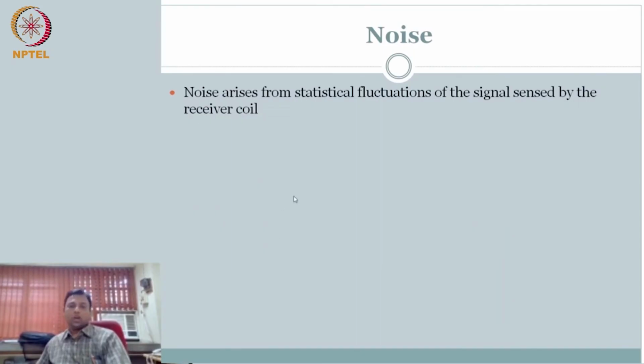Okay. So noise. Where is the noise coming from here? The noise that we are interested in covering is coming from the measurement. Here we do only one measurement. What is that measurement? We are using a receive coil and receiving the data. That's the only place we are actually doing a measurement. After that, you digitize, you do all the computation. So the only data noise that comes during data acquisition comes from your receiver coil.